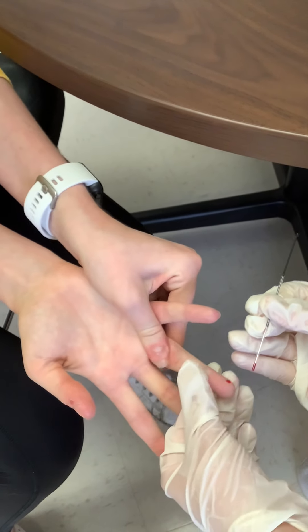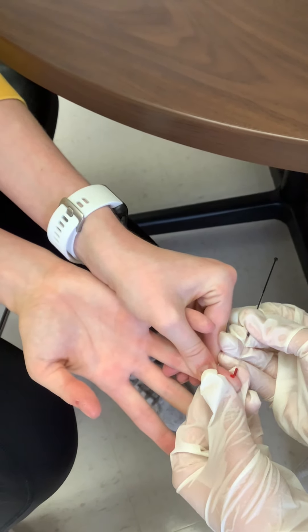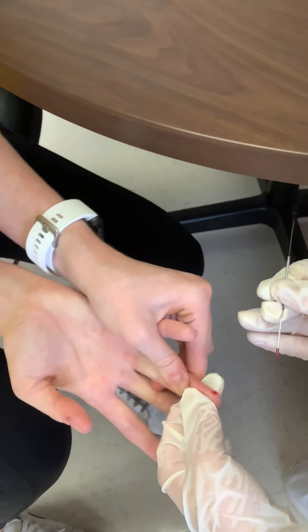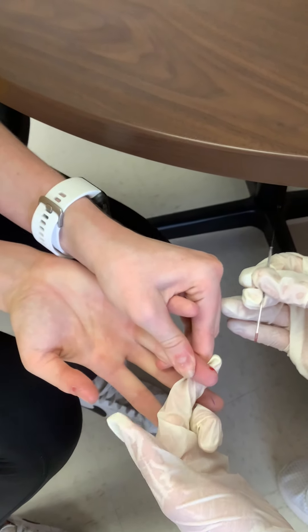You're going to want the blood to make it all the way to the black line on the capillary tube. It takes a little bit, and timing is of the essence. There you go.